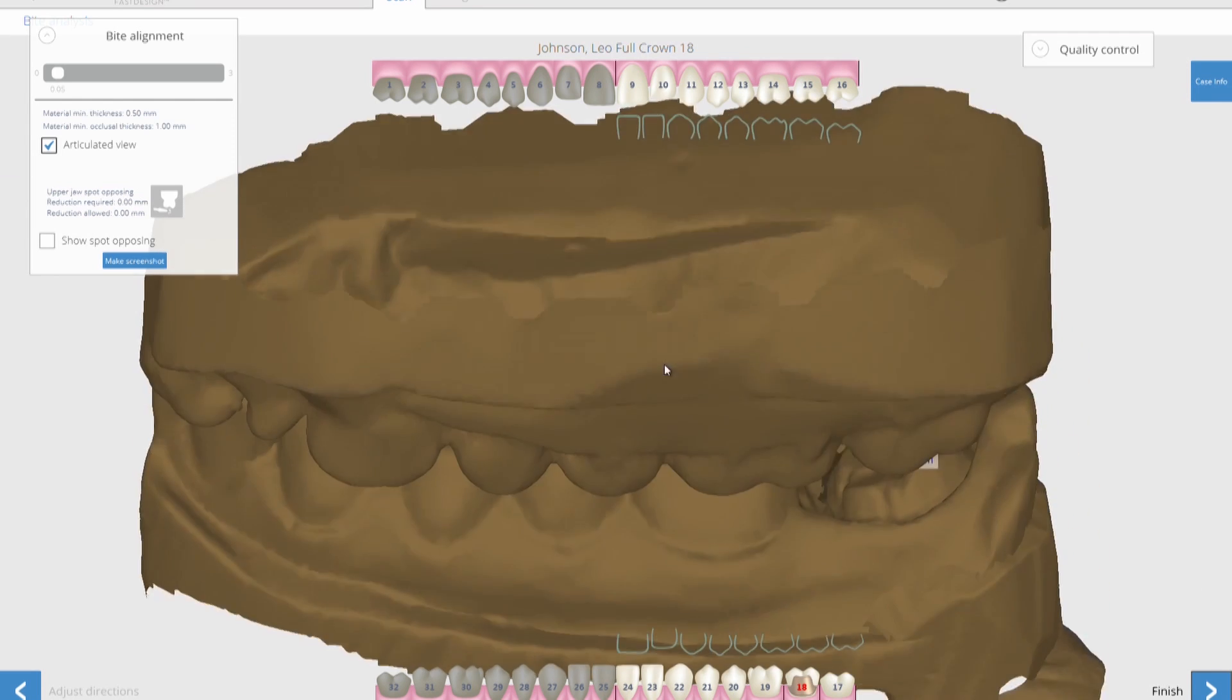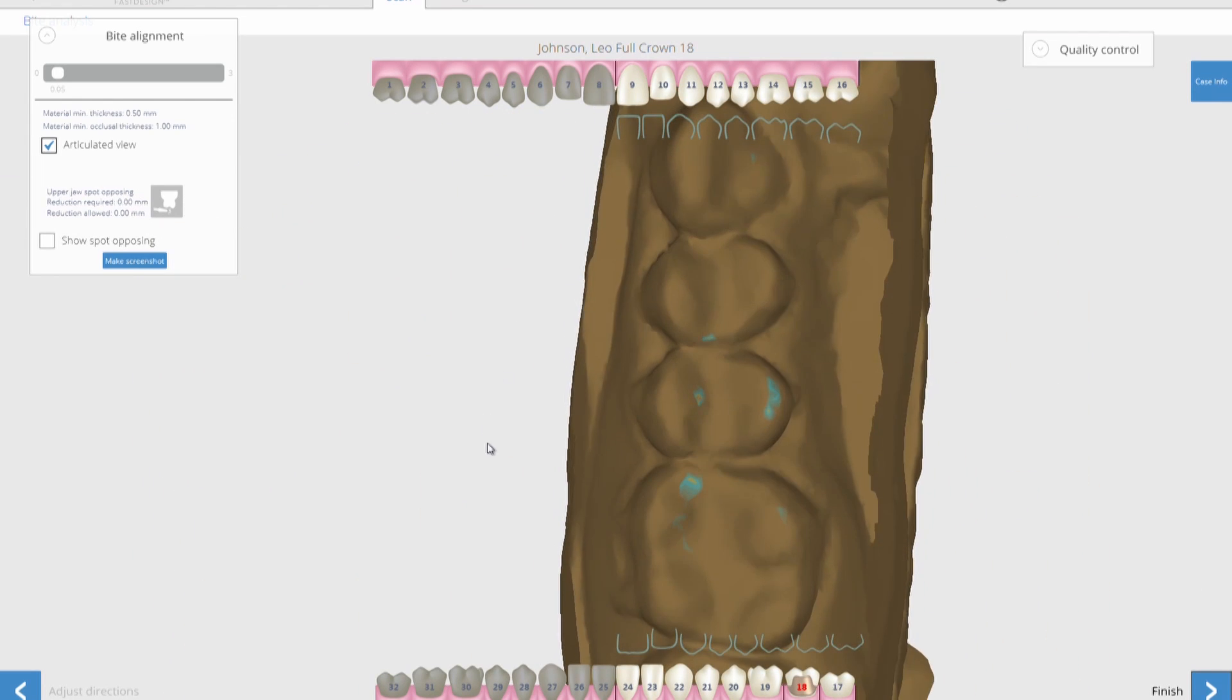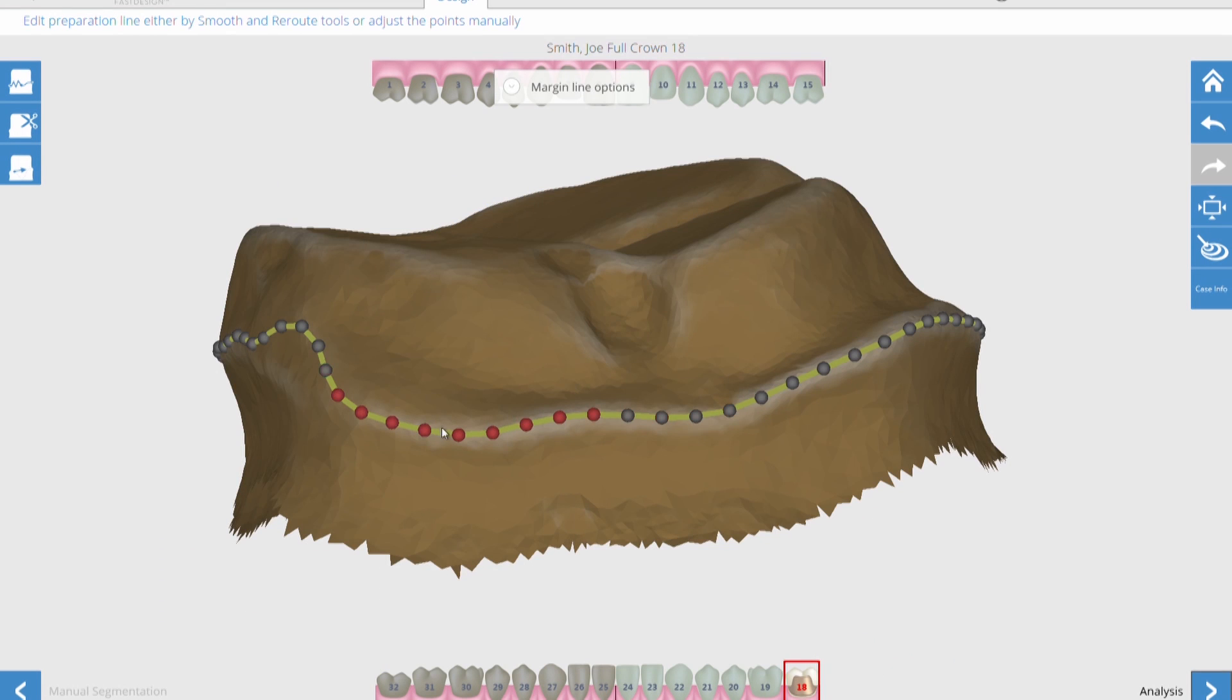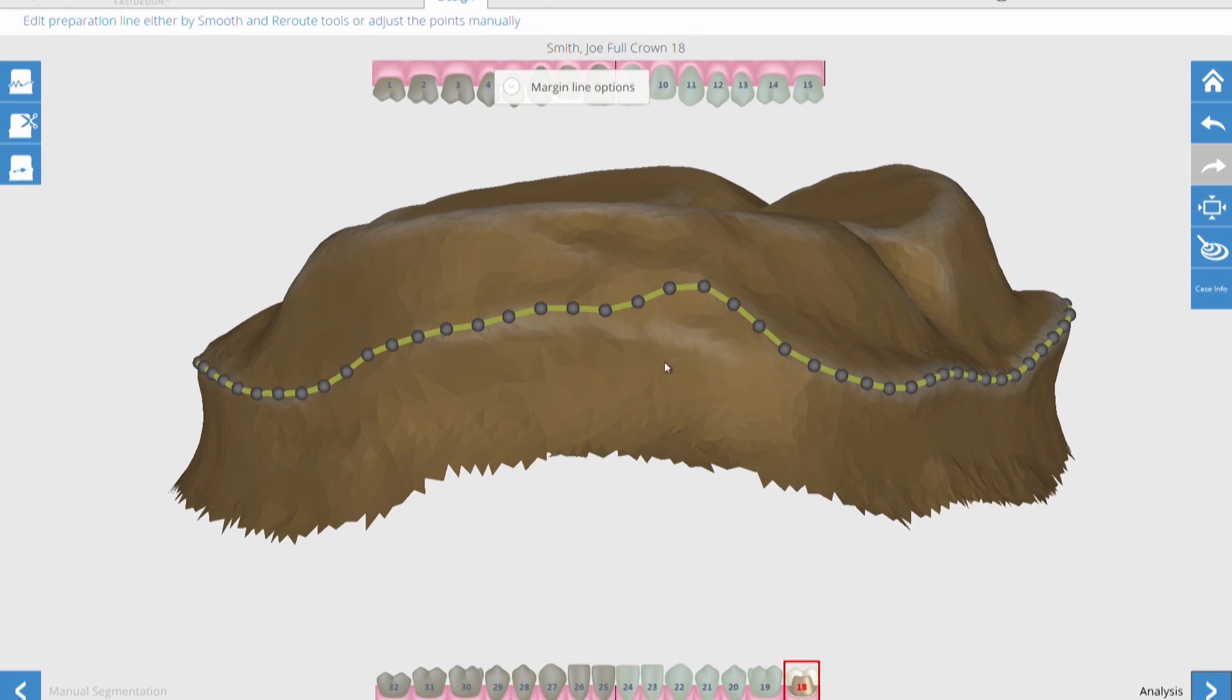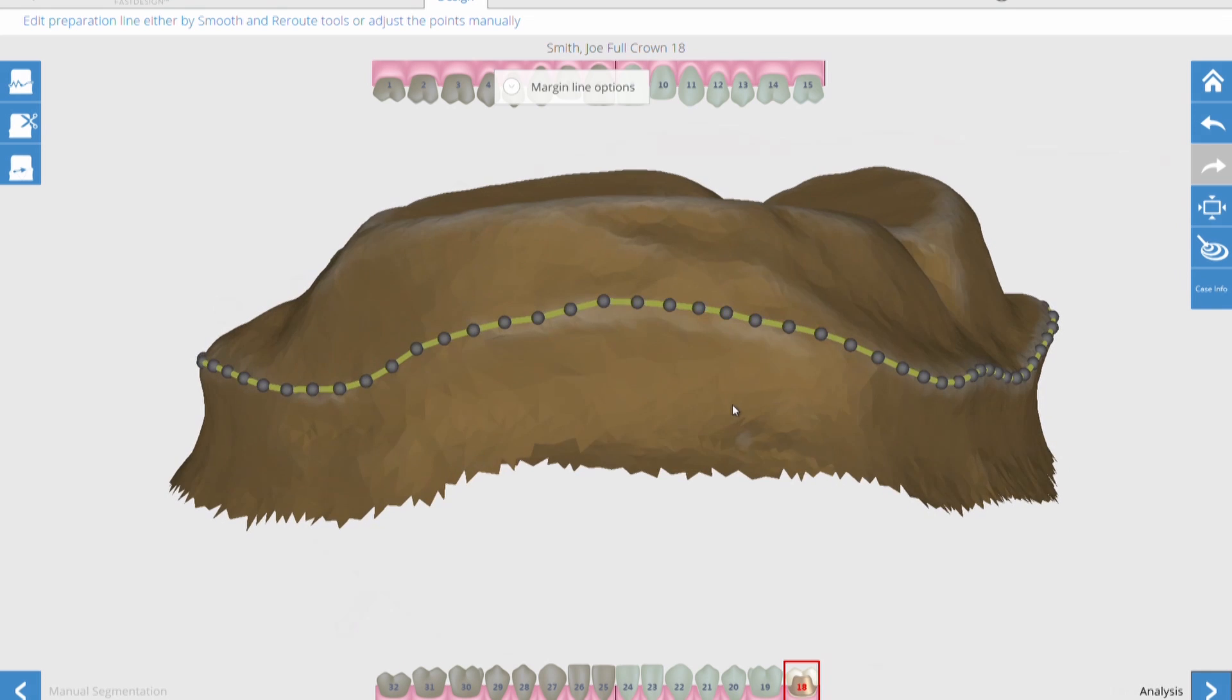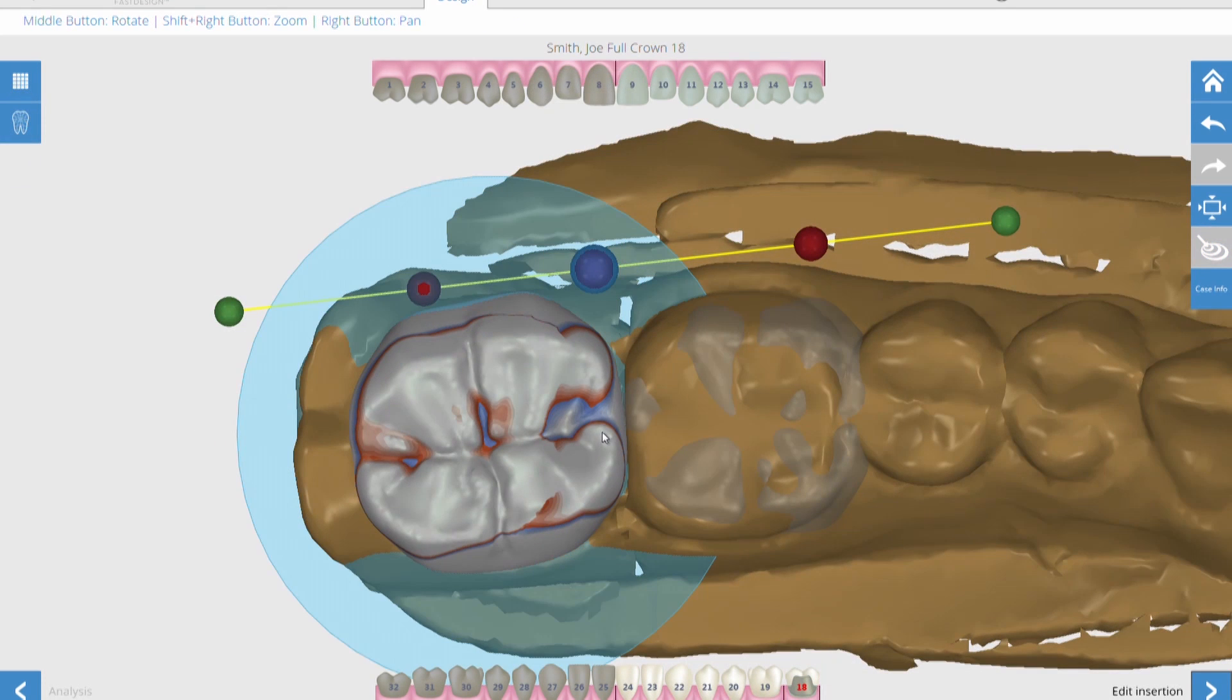You can also design your restoration if you want to using the software, and you can see that it automatically marks the margin for you. But if there's kind of an indistinct margin like there is on this tooth, you can pull it and adjust it and put the margin wherever you want to.